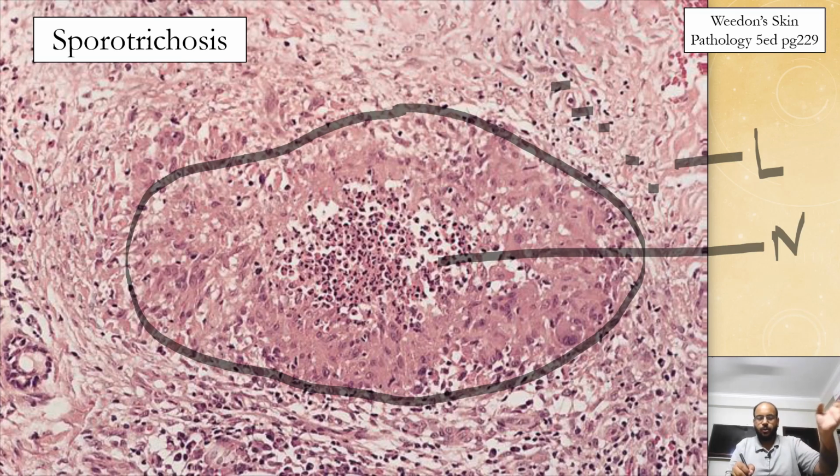Okay, just go back and see the slide of histopathology of dermis, where we have talked about how to identify neutrophils. So these are formed by neutrophils. Okay, so you have a granuloma of histiocytes. In the center of the granuloma, you have neutrophils, and outside the granuloma, you have majorly lymphocytes. So there are two types of cells. You have acute neutrophils and chronic lymphocytes, and then it becomes a mixed cell granuloma. Okay. And if you look closely, you can actually find foreign body giant cells, but for that you need to go to higher magnification.